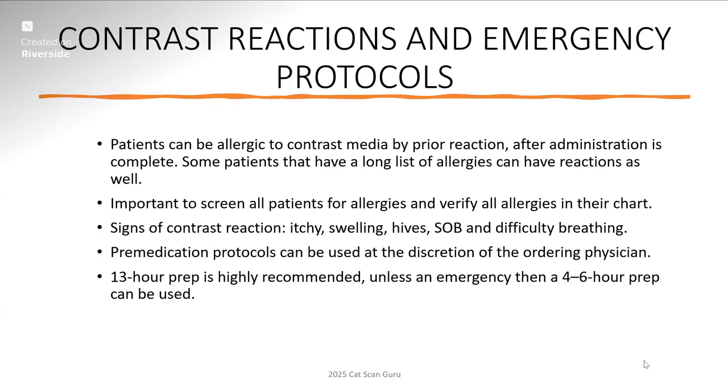Now, contrast reactions and emergency protocols. Very often we get patients who are allergic to contrast because they've had a prior reaction from a prior test, or they've had a reaction after we've given them contrast, or I've seen patients become allergic to contrast because they have a long list of allergies, which puts them in a high category.